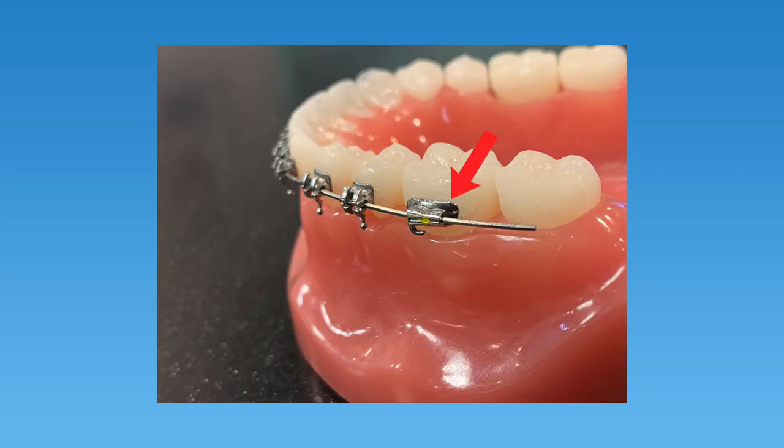So does a broken bracket hurt? Generally speaking, a broken bracket doesn't hurt. It might feel a bit annoying as it slides around on the wire, but usually there's not too much discomfort. If one of the brackets on the back teeth breaks, it may expose the end of the arch wire, and this poking arch wire can cause discomfort and may irritate the cheek.